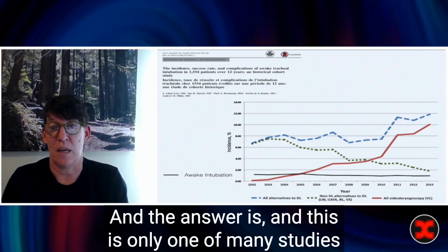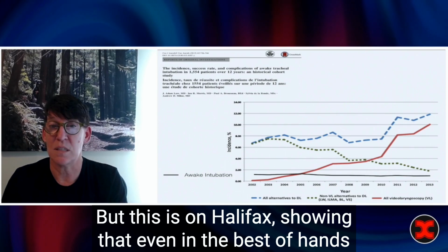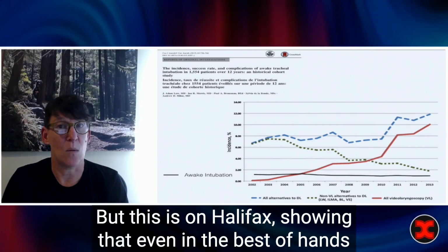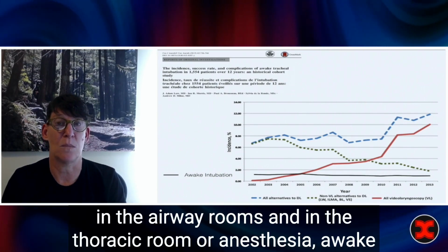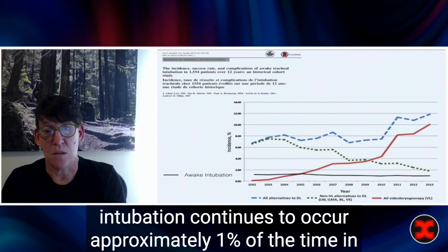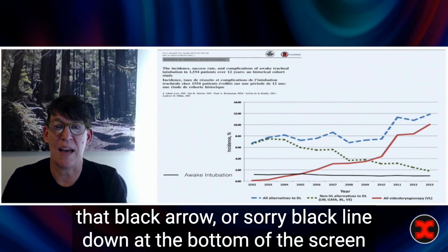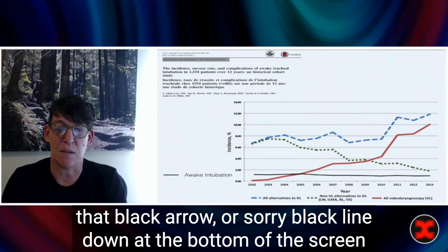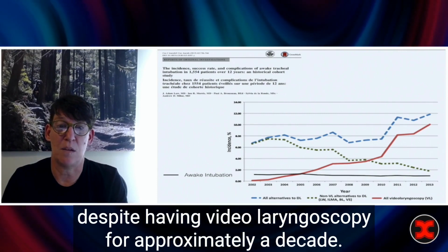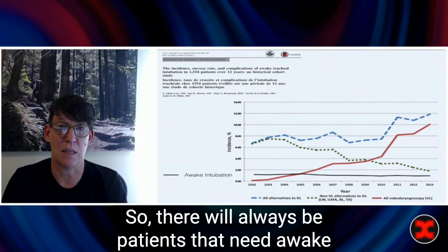And the answer is, and this is only one of many studies that have now come forward, but this is out of Halifax, showing that even in the best of hands in the airway room, in the thoracics room for anesthesia, awake intubation continues to occur approximately 1% of the time, in that black line down at the bottom of the screen, despite having video laryngoscopy for approximately a decade. So there will always be patients that need awake intubations.